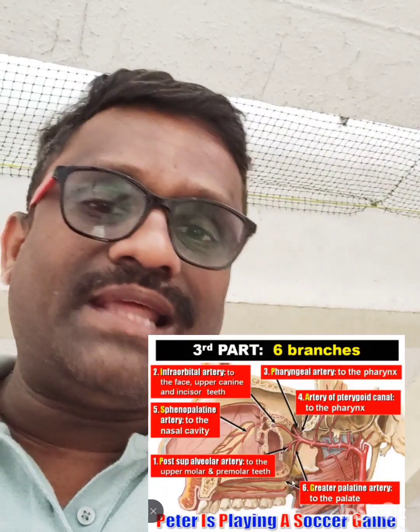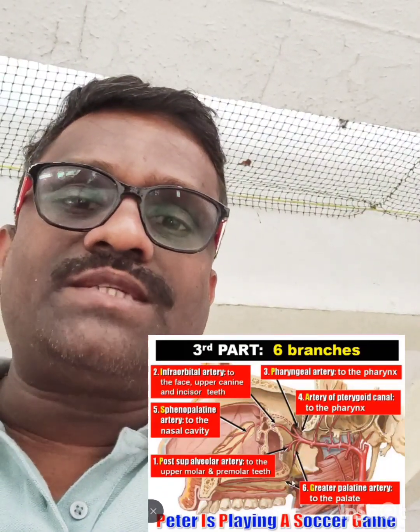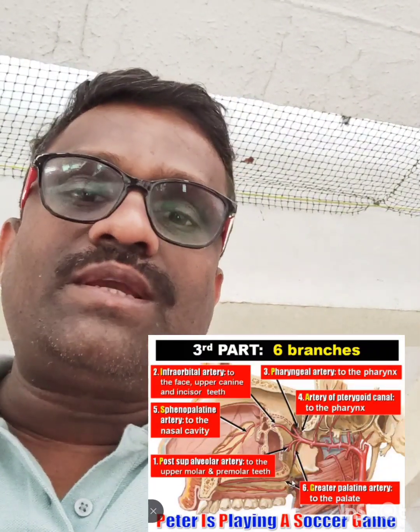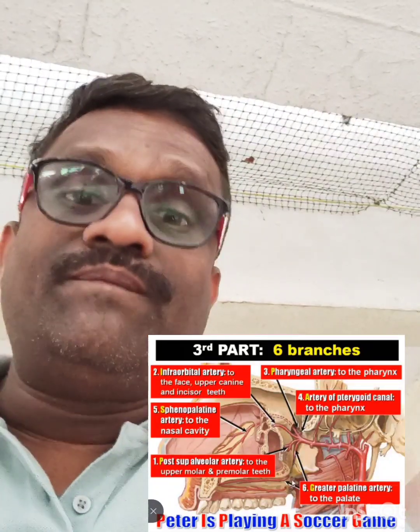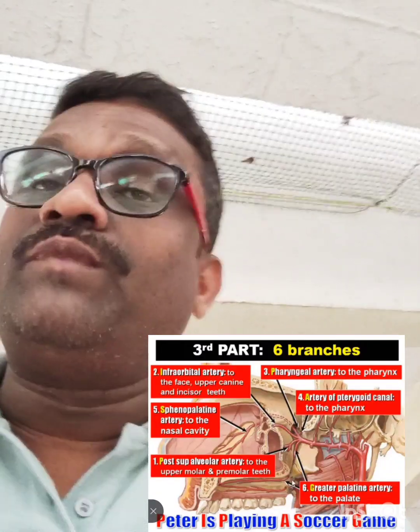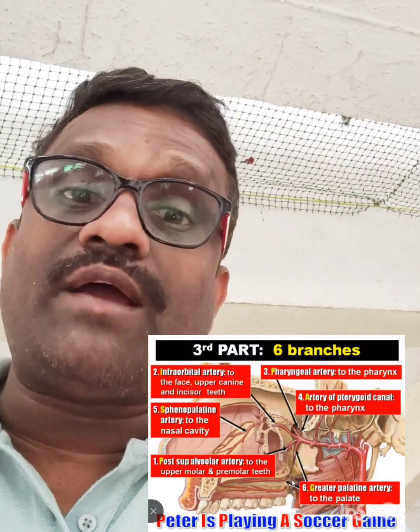Usually we won't place that length of pterygoid implant. We place a maximum of around 29 or 30 mm, so usually we won't damage the maxillary artery, but we have to be careful while placing lengthier implants here. The pharyngeal artery, the branch of the third part of the maxillary artery, we are not supposed to damage at all. The patient will have many complications if the pharyngeal branch is damaged. So we have to deal with the maxillary artery while placing the implant in the pterygoid area. This is the main anatomical importance while placing pterygoid implants: to take care of the maxillary artery.